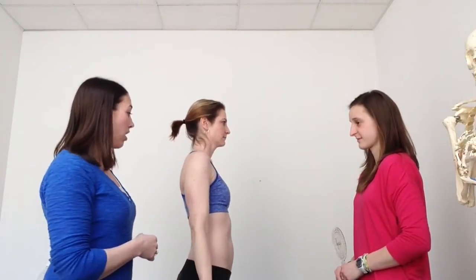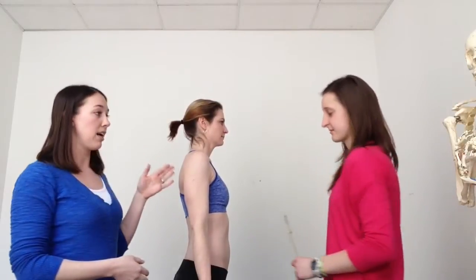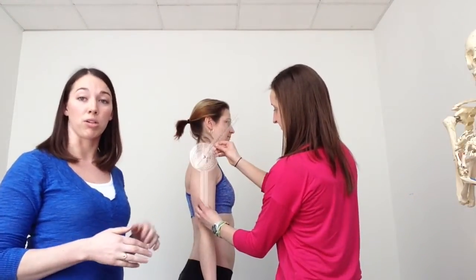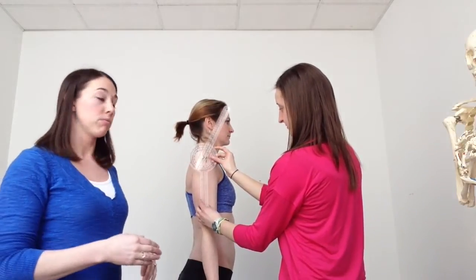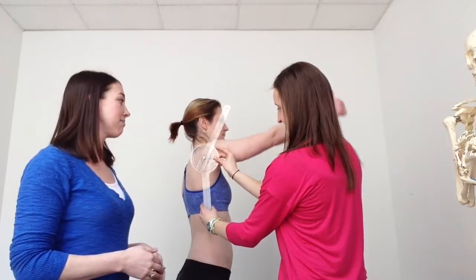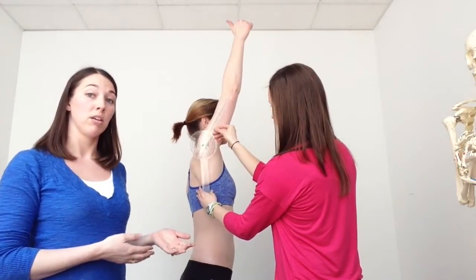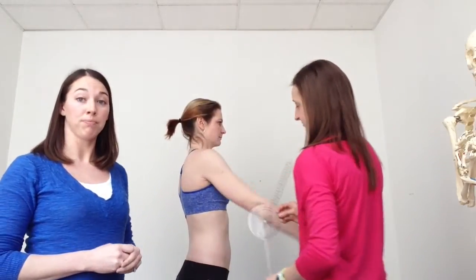Perfect. So you'll ask your patient to start in a dependent position, then go ahead and line up your goniometer in an estimated position of where you think they're going to be, and then have them repeat that flexion movement. Good. And align your goniometer as you did before. Then go ahead and have them relax their arm down once you've taken that measurement.